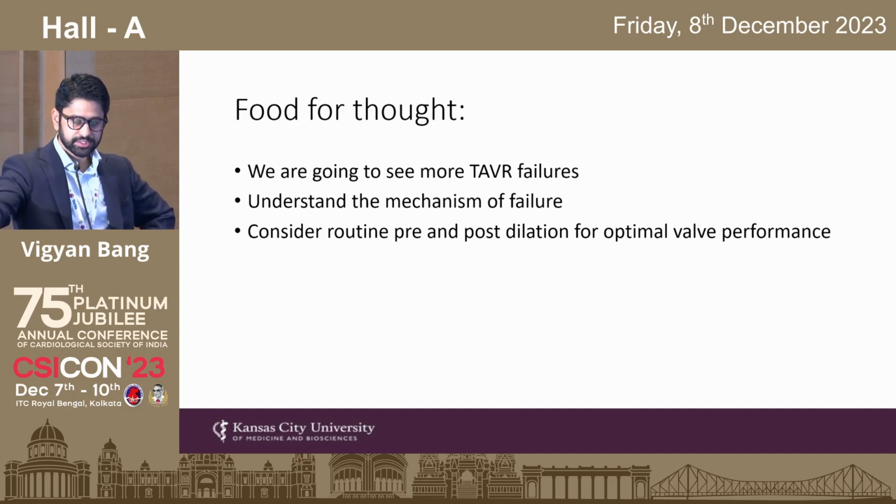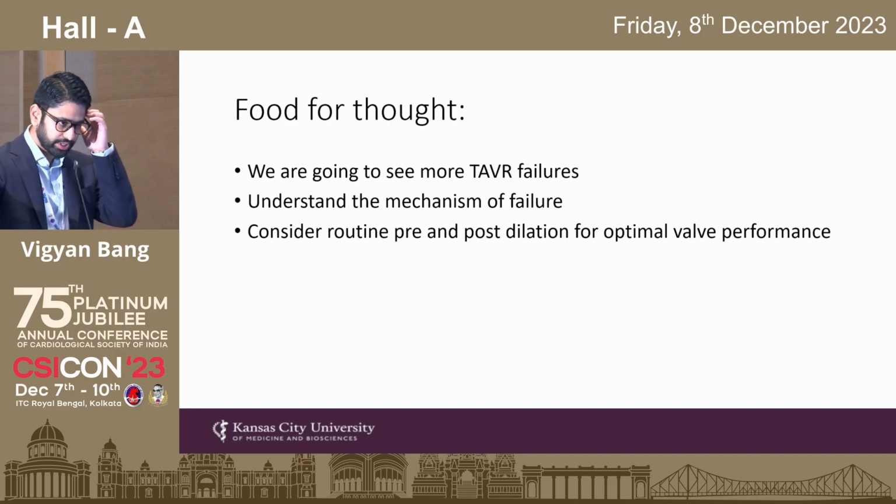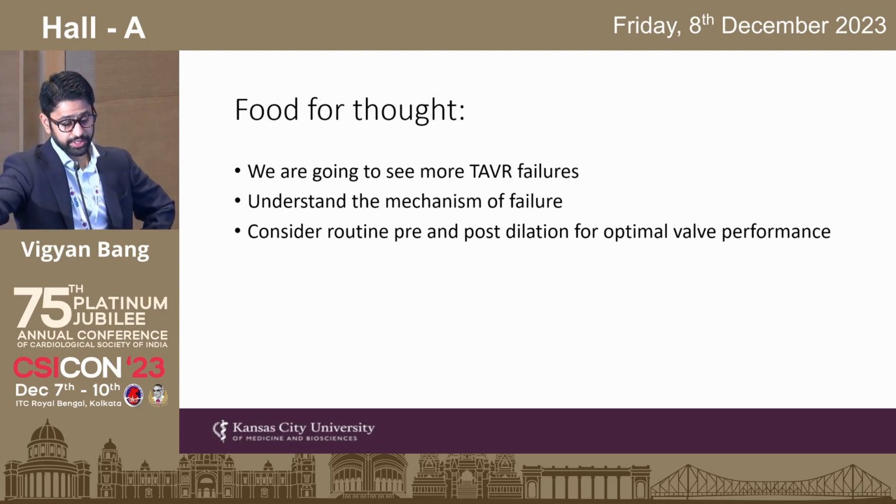And a couple of these cases have now made me wonder whether we should be aggressive about routine pre and perhaps post dilation in these patients with severe bioprosthetic valve stenosis to optimize these gradients on the day of the procedure.